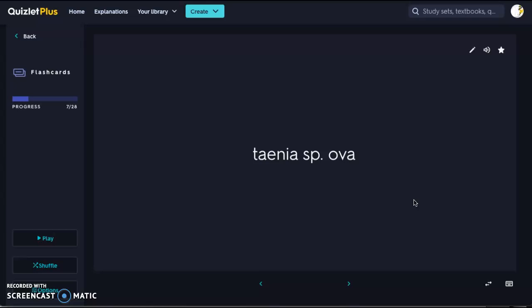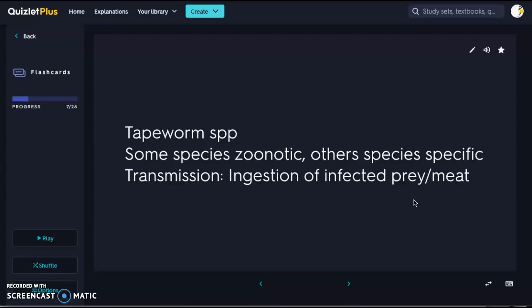First we have our Taenia species ova — Taenia are tapeworm species. Some of these species are zoonotic; others are species-specific and are not going to be transmitted between different species. The transmission is ingestion of infected prey or meat. So if an animal catches a mouse that's infected and eats it, it will then be infected. If humans are consuming raw meat, we can be infected that way.